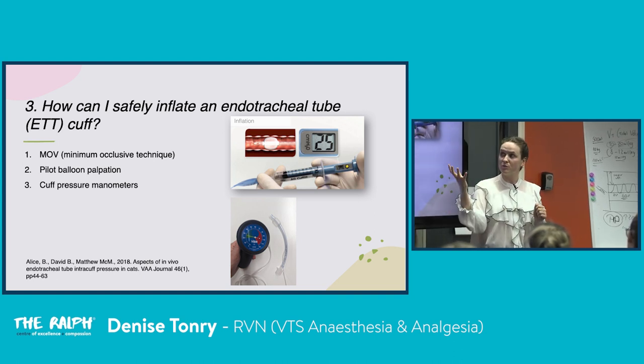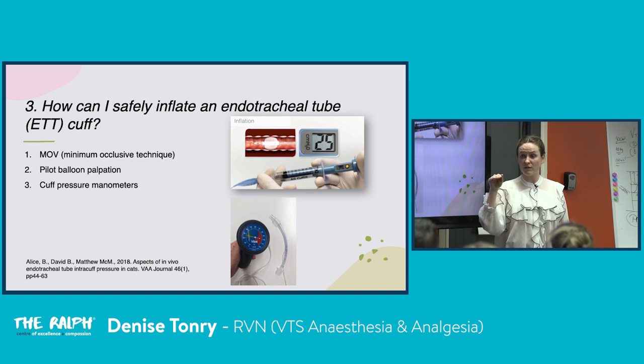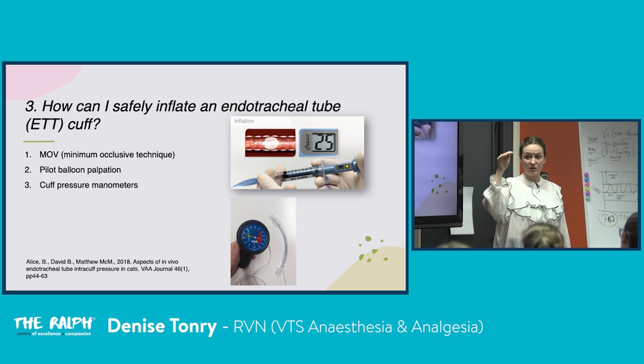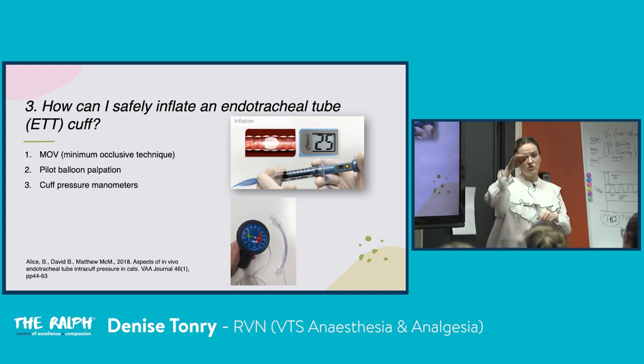What's happening when people do squeeze the bag like this, and I know because I've done it for years, squeeze, do you hear a leak, squeeze, do you hear a leak, is that we're using far too high pressures. They're not physiologically relevant. If that patient spontaneously breathes, he'll never reach a pressure high enough to cause a leak in that system. So this is trying to abolish that. So if we drop it down to 20, patients breathing at 1-2 centimeters of H2O will never leak. And if we provide IPPV or manual IPPV or mechanical IPPV, we'll equally never achieve pressures like this. So we'll never cause a leak.